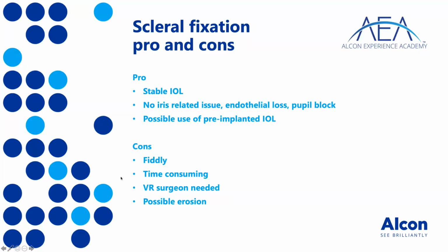So this is a very fiddly technique, and it's incredibly time-consuming. Personally, I don't use it very much, and that's probably one of the reasons it takes me forever to do it. But I've seen people who constantly praise this technique and always use it, and it takes them time. And when I say time, I mean 1 hour plus to do the procedure. It's always very time consuming.